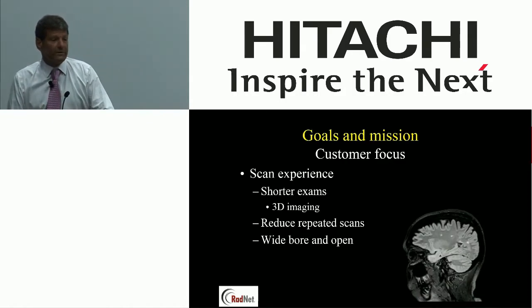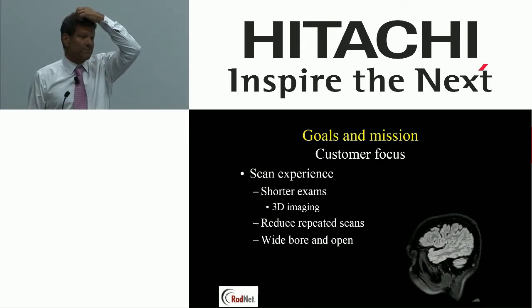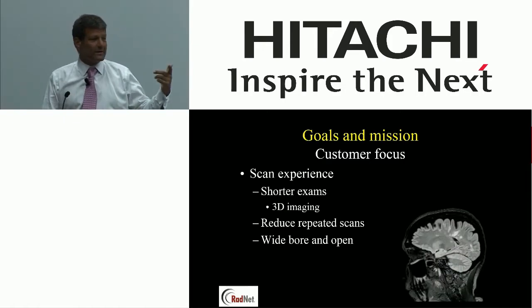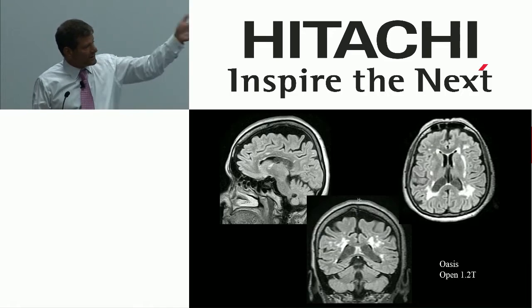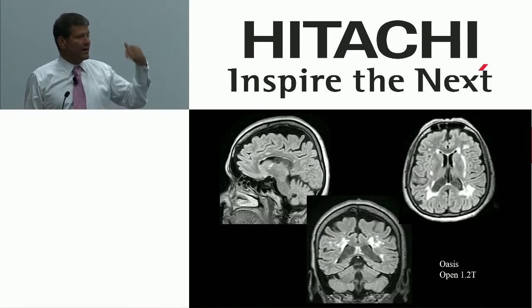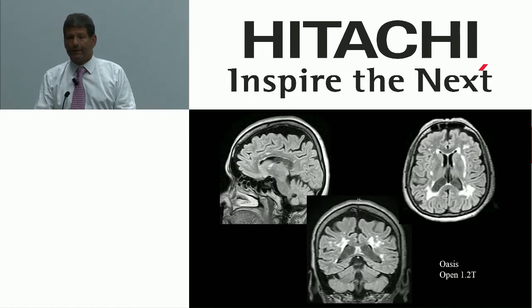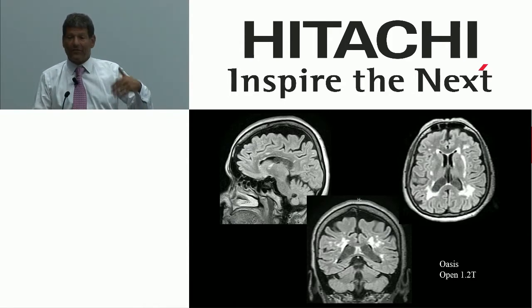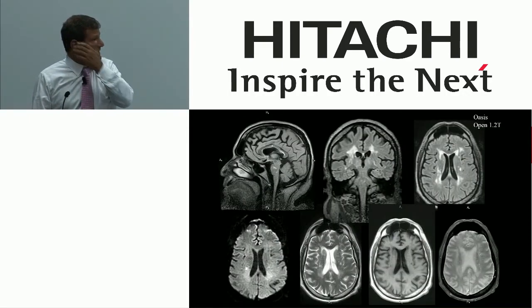Another way to use new techniques to go a little bit faster: anybody ever do a sagittal FLAIR and an axial FLAIR? Happens all the time. The most efficient way, once you're going for more than one scan, is to move to a 3D scan. We routinely do a 3-plane 3D FLAIR, as in these examples from the Oasis, instead of doing two 2D scans. So instead of taking 8-9 minutes, I might take 5 minutes. And the benefit is I get the third plane for free, and all the slices are thinner. This is very widely accepted in our practices.